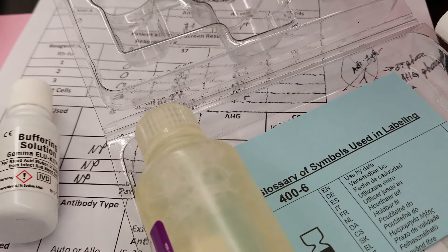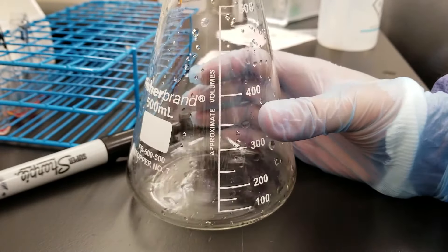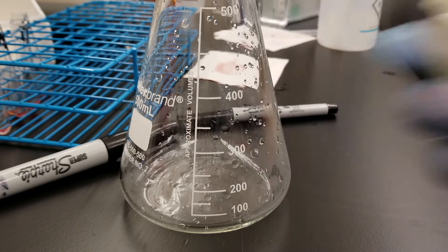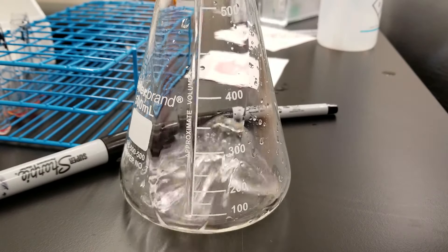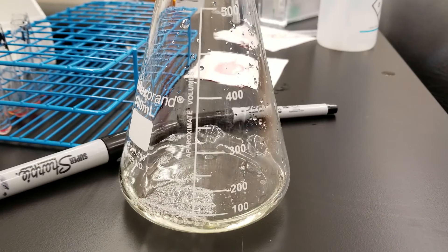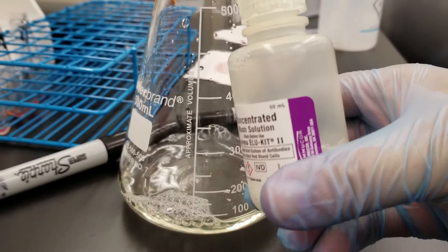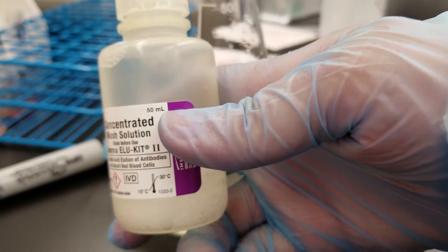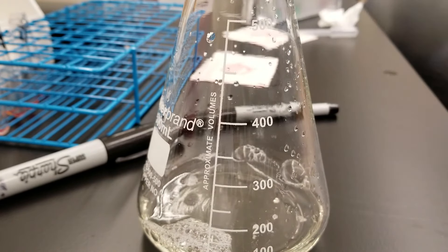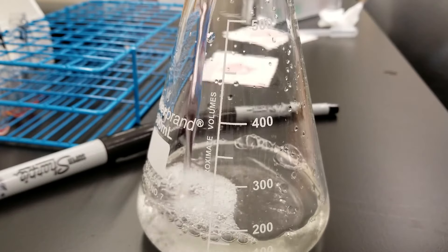So let's get this started. I have an Erlenmeyer flask here that I made sure was clean in order to make the working wash solution. You take the entire bottle of concentrated wash solution and pour it into the container you're going to use. This is a 1-to-10 dilution — the bottle contains 50 milliliters, so I have to add water all the way up to 500 milliliters to make the 1-in-10 dilution. I'll add the water and then the wash solution will be ready to go.